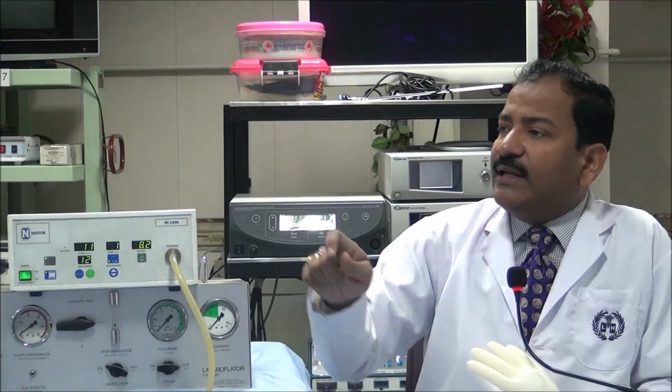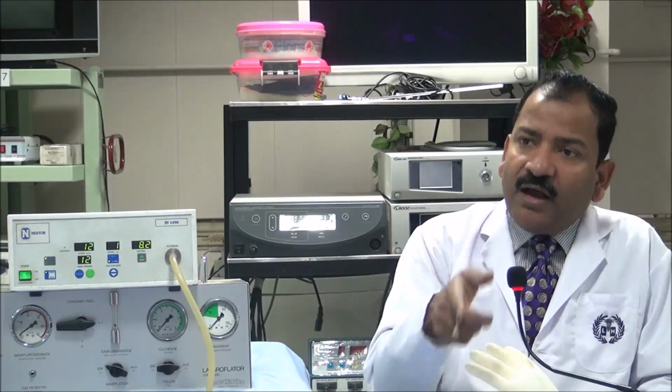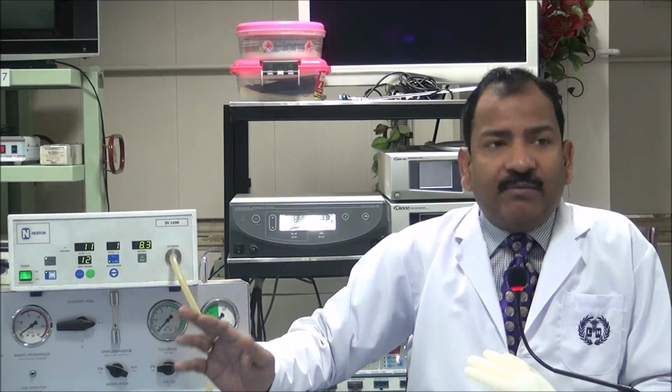What are the corrective measures? If a skin wound was big, I will give one stitch. If there was some problem with the valve, I will change the valve. If I have forgotten to put the reducer, and I am using a 10 mm port with a 5 mm instrument without reducer, and the abdominal wall is deflated, then immediately it will draw my attention and I will put the reducer, so that I can stop the unnecessary leak.